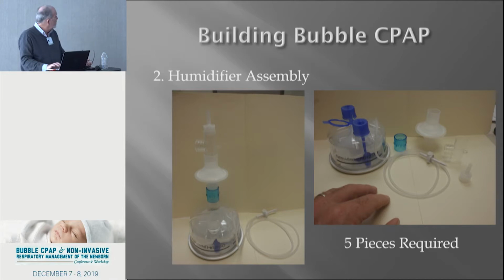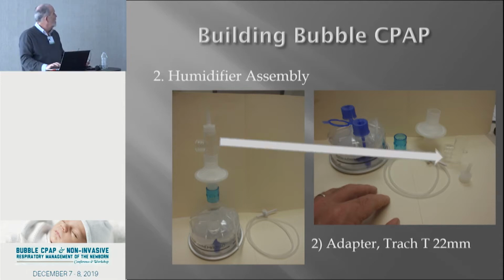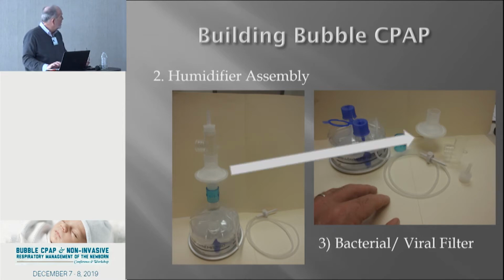If you go, there is a nipple adapter. Because it comes off the wall, you usually use a supply tubing, which is a very narrow gauge. We usually put a T-piece in line because we would always just keep an analyzer on board. Some places don't do that. They just check them periodically. Most blenders are pretty accurate. You can sort of look at it and you're pretty darn close. But we just kept it in line as a general link.